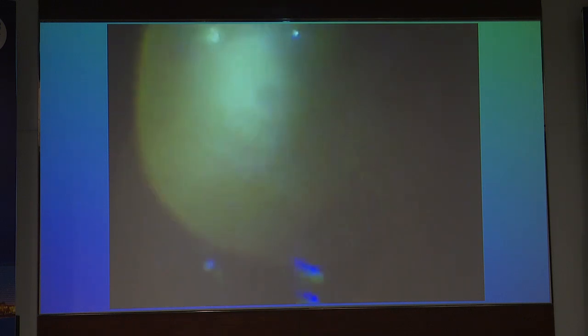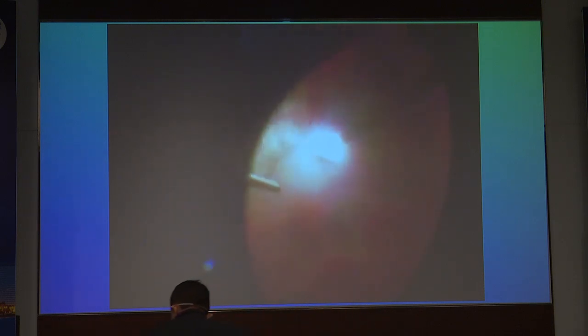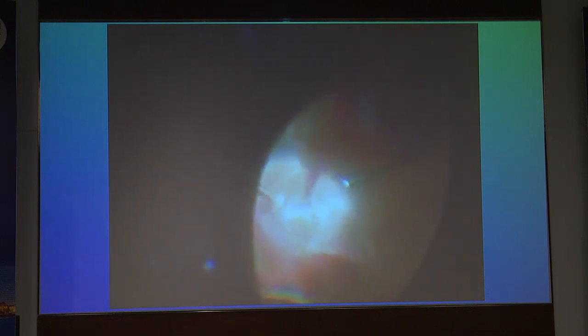So that's why you have to do a B scan, and depending on the type of injury, whether it is an MRI or a CT, you decide the investigation, and localization of the foreign body is important. In spite of all the experience, sometimes there is an intrascleral foreign body, or the foreign body is projecting outside. Finally I saw the pellet in the vitreous hemorrhage, and that's what I have located. So now I am using the same 12 o'clock incision, grasping with the forceps and removing it. Still the remnant of vitreous hemorrhage is there. The idea, as I said, is for the foreign body not to fall on the surface of the retina.